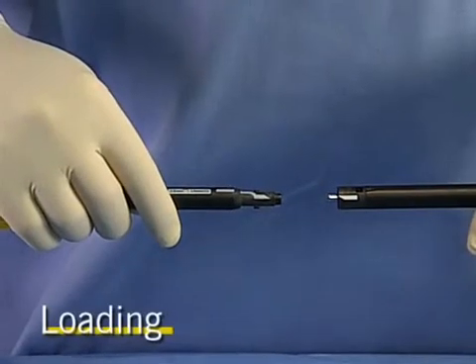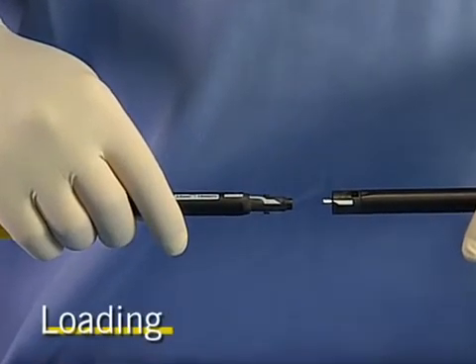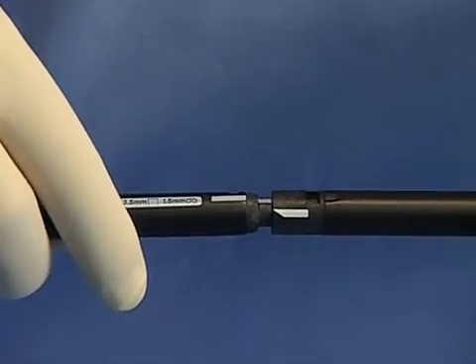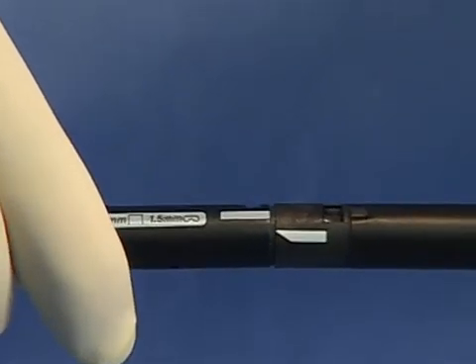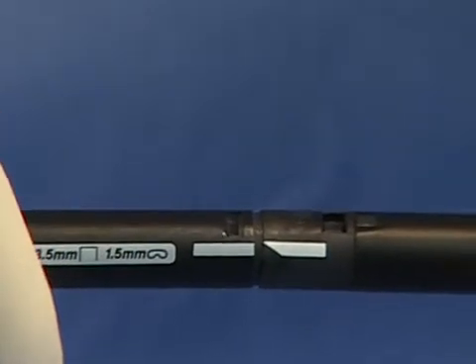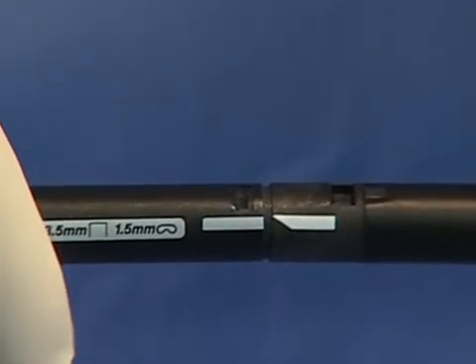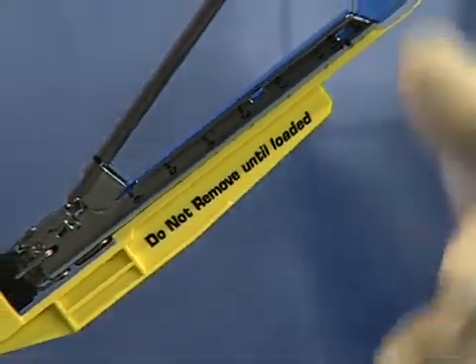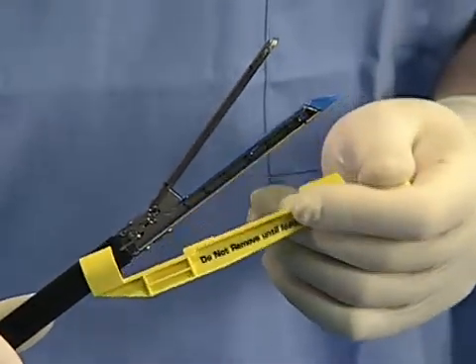Loading Instructions. To load the EndoGIA Universal Stapler, line up the white line on the instrument shaft with the white line on the loading unit. Push together and twist clockwise until you hear an audible click. After the loading unit has been clicked into place, remove the yellow shipping wedge.